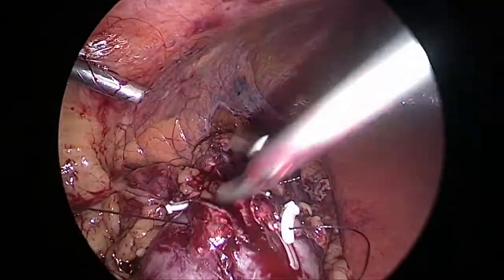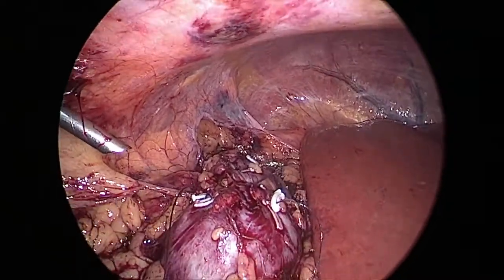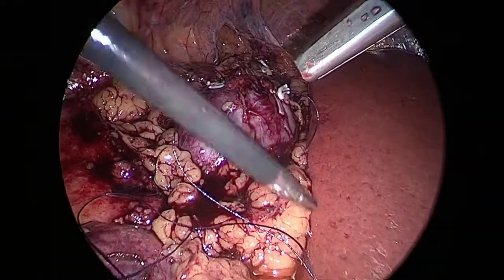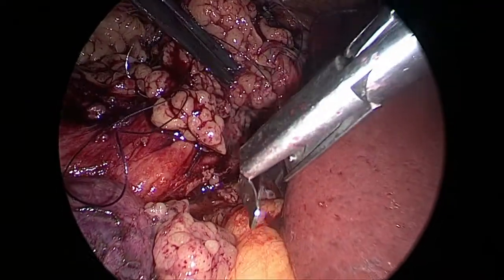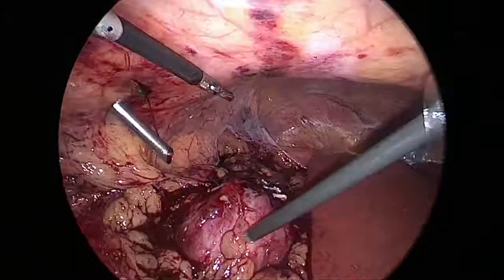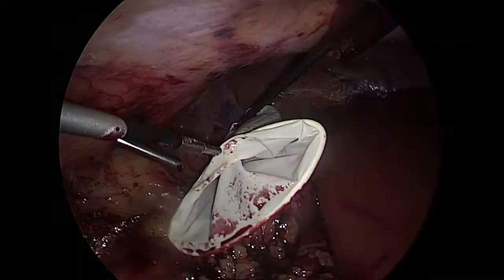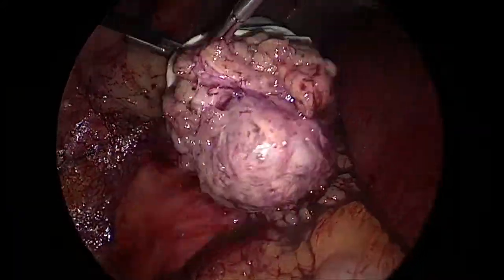After completing the renorrhaphy, we will remove the bulldog clamp. Now we will remove the bulldog. You can see there is no active bleeding. Now we put the gloves back for retrieval of the specimen.